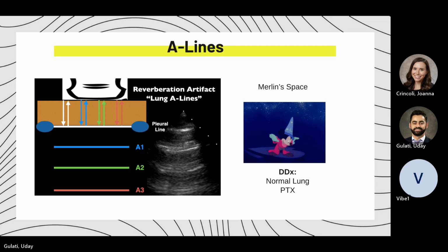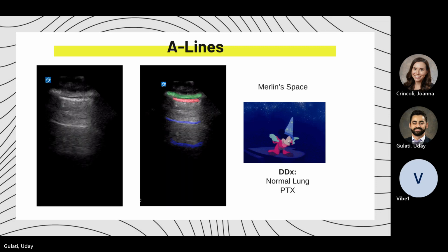And that artifact is so thick that it'll reflect off that artifact, go back to the probe, and then you have all these waves that are going here. Some of those waves reflect backwards, and then it'll create a mirror of that reflection here, and then this will create a mirror of that reflection to here. And that's what these A lines are. And I usually want to see 3 A lines when I deepen my space. Any questions about A lines?